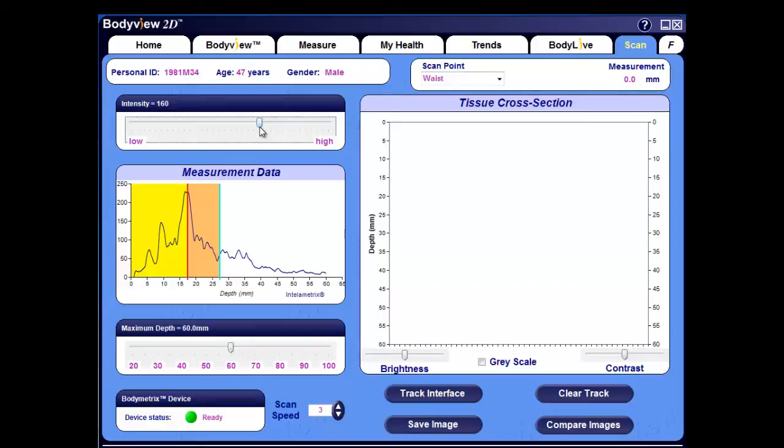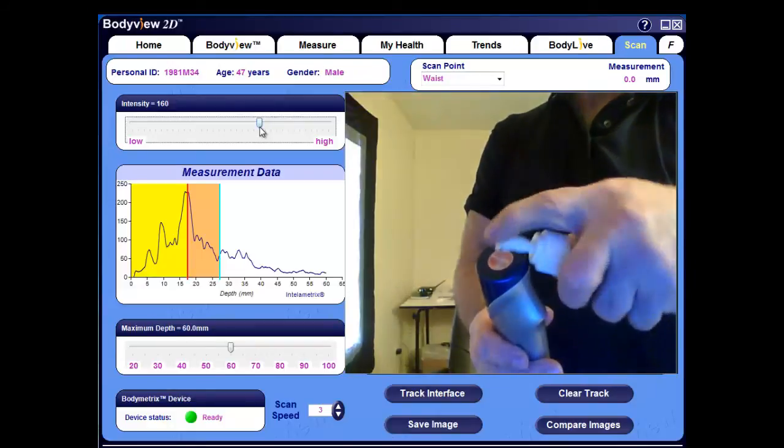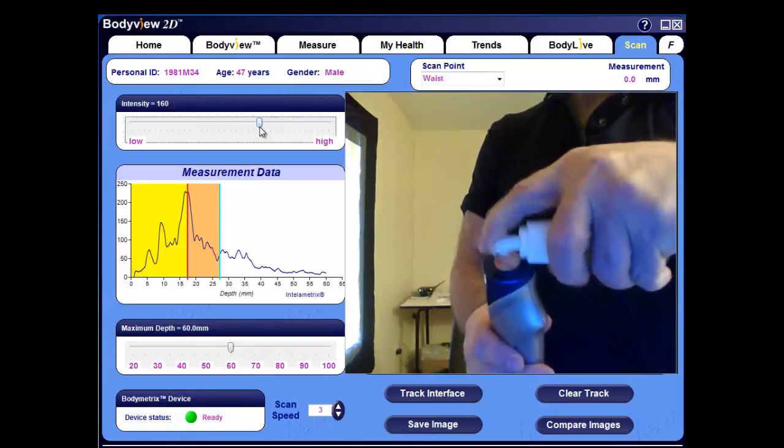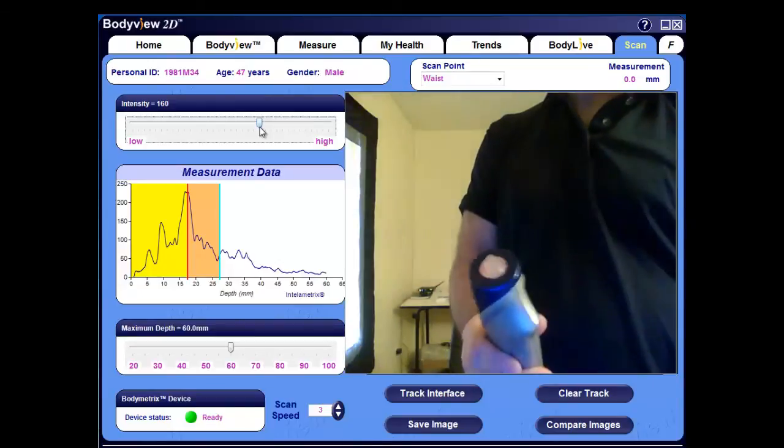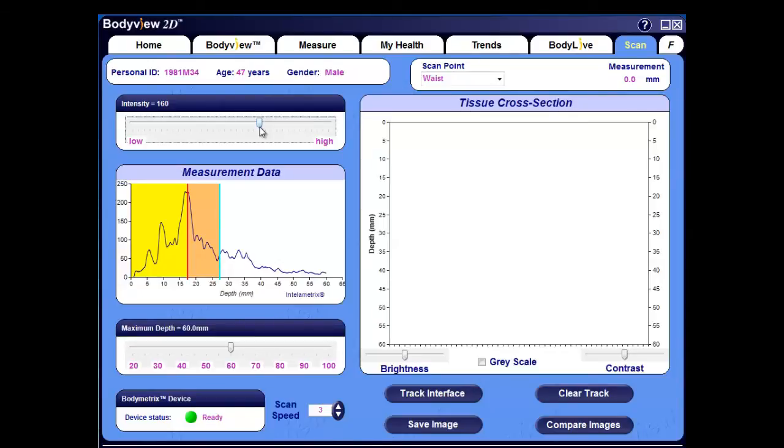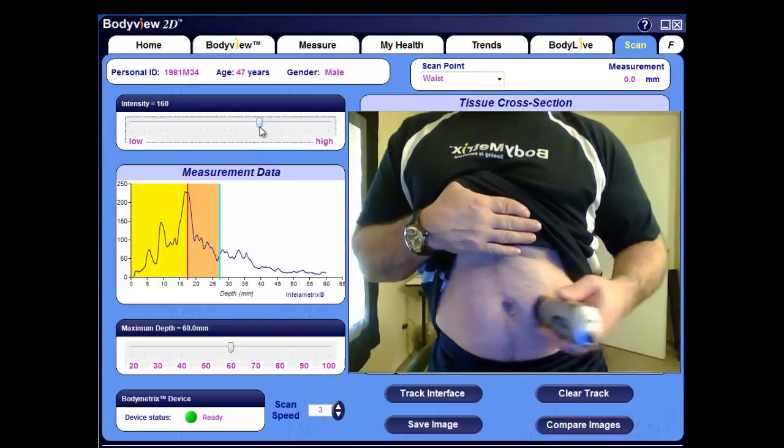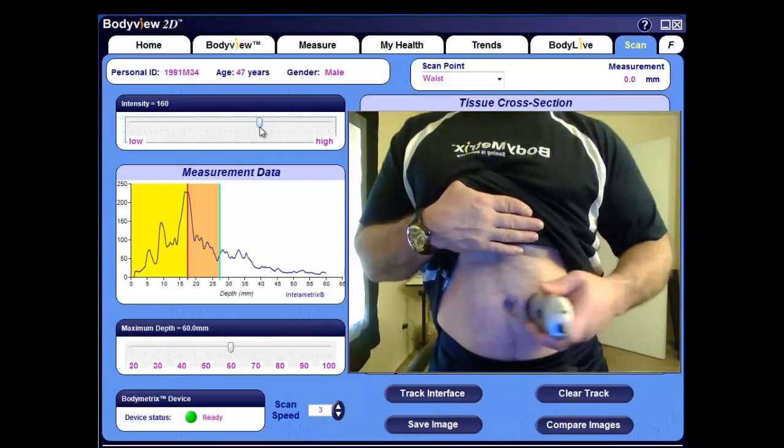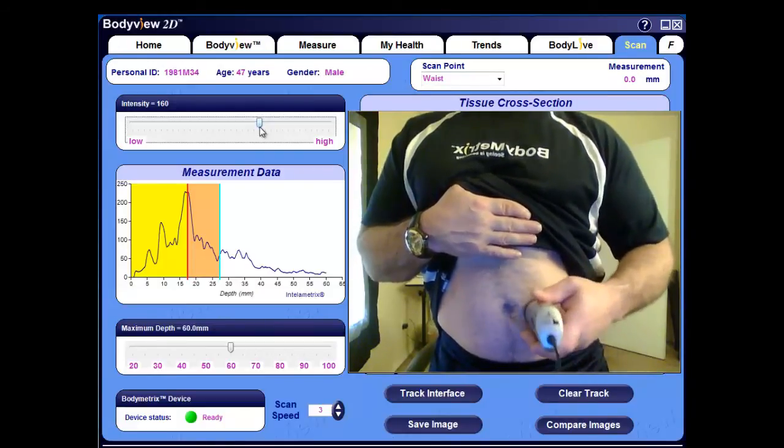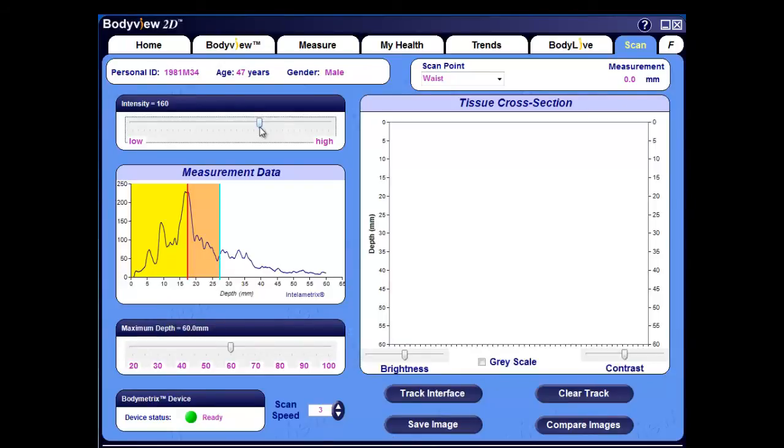Next, you'll apply a quarter-sized amount of gel to the head of the BodyMetrics device, as shown. Beginning one inch to the right of the umbilicus, spread the gel approximately three to four inches horizontally towards the right side without pressing the button, as shown. You're moving the device back and forth to ensure it glides smoothly on the skin without binding or sticking.